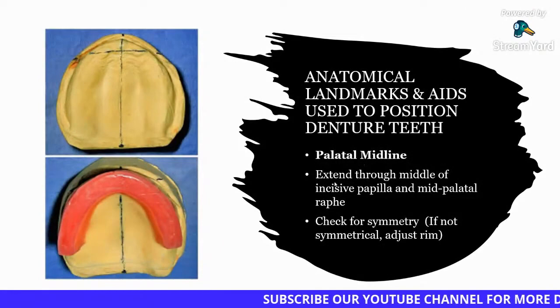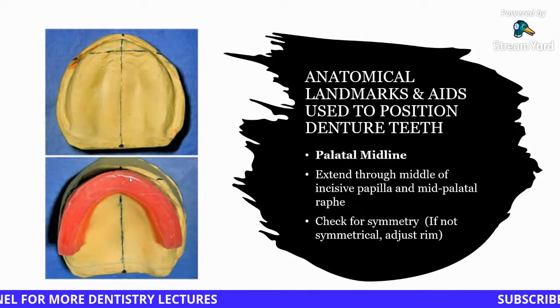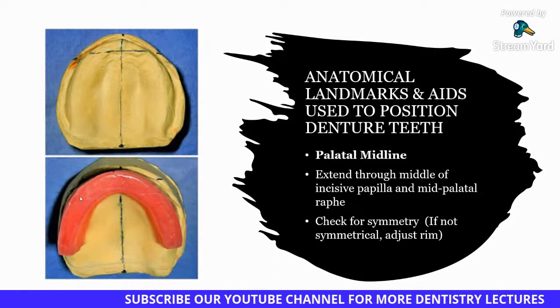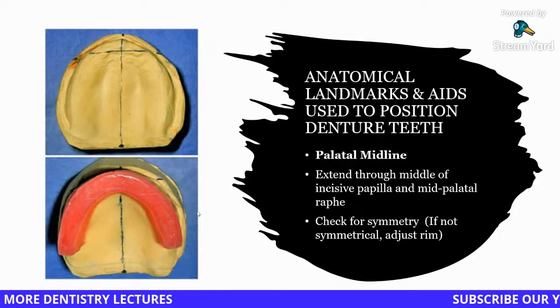Then the palatal midline extends through the middle of the incisive papilla and the mid-palatal raphe. In this condition, we have to check for symmetry. If our rims are not symmetrical, we can adjust our rims before starting the setting up of the teeth.